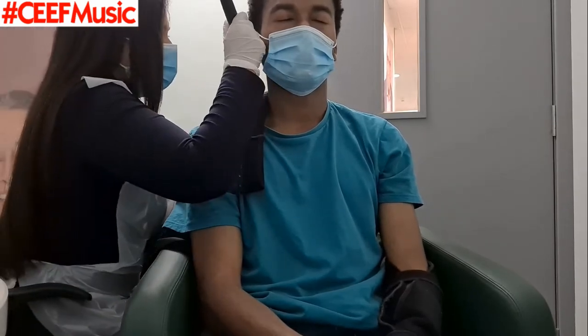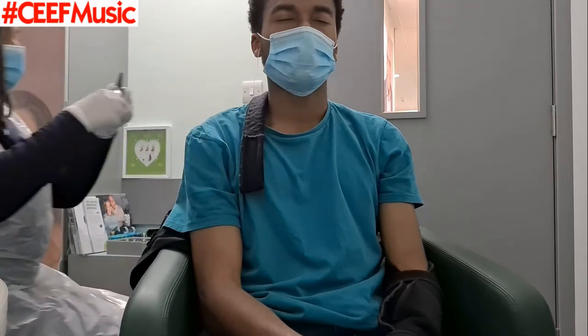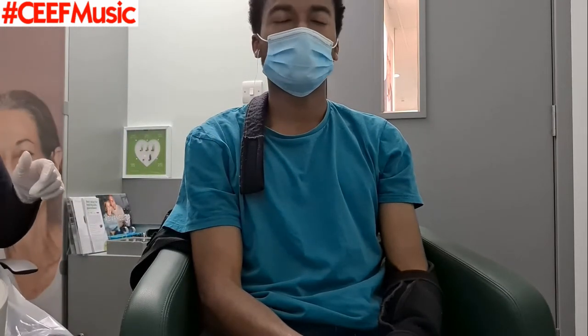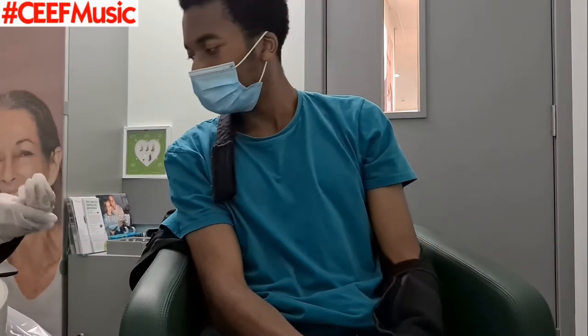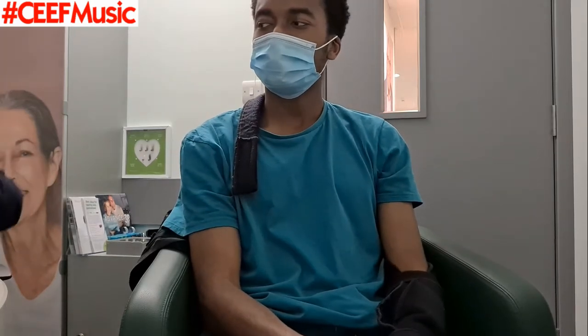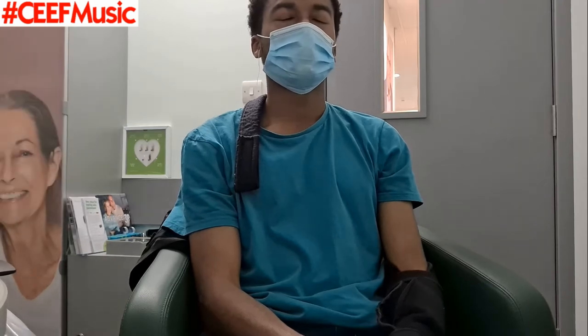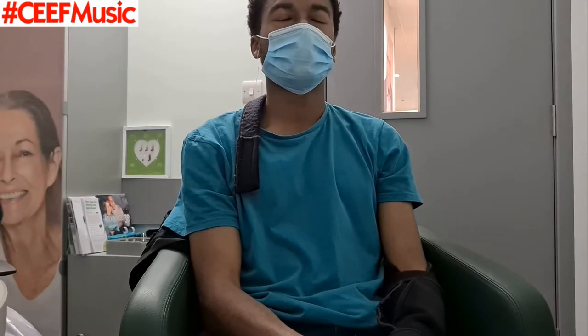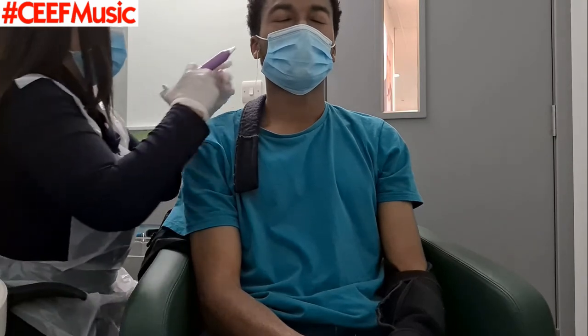I think we've got a final check going on because what just happened was there was a sort of cotton thing — I don't know what the material is — that's installed into the ear so that when they mix this Play-Doh like material, you can then actually extract the impression after it's been taken. So yeah, now tubing — I guess you could call it tubing. Look at that purple, wonderful color.